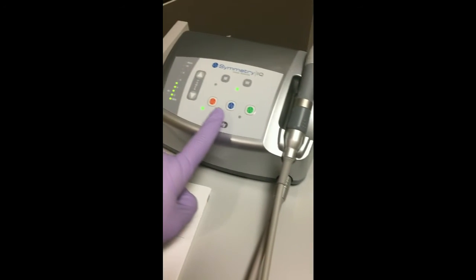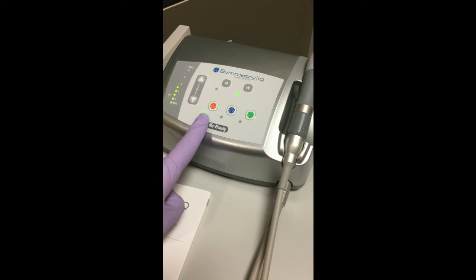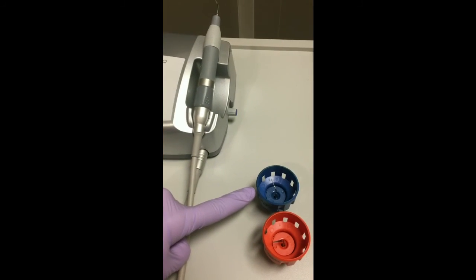Each tip is color coded per button according to the guardian wrench. The orange is for the orange guardian wrench, and the blue is for the blue guardian wrench.